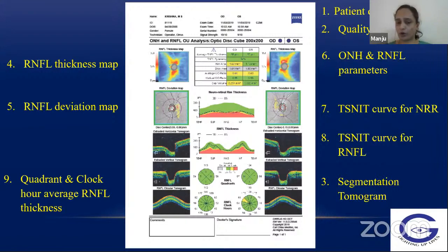If the area of the optic disc is less than 1.3 or more than 2.5 square millimeters, it is outside the scope of the normative database, and this is also shown as gray. The normative database is not available for age less than 18 years.